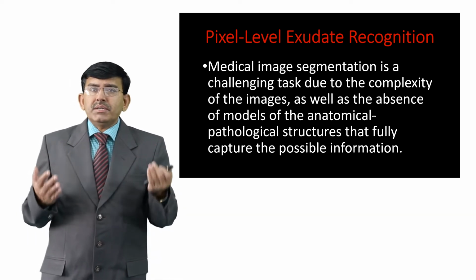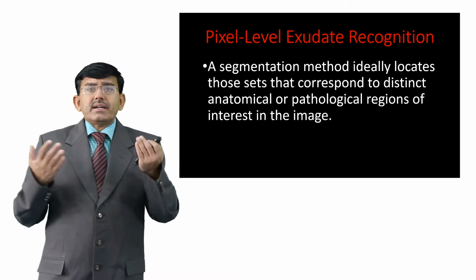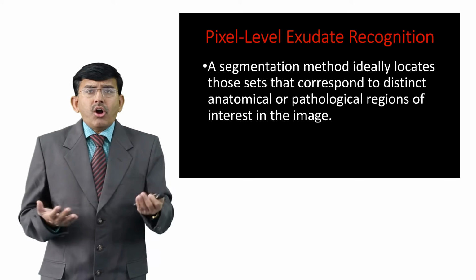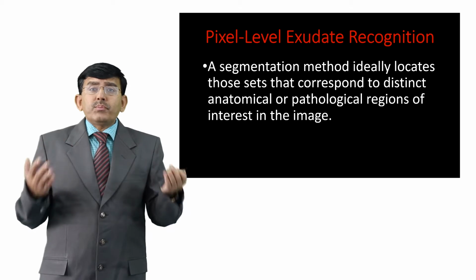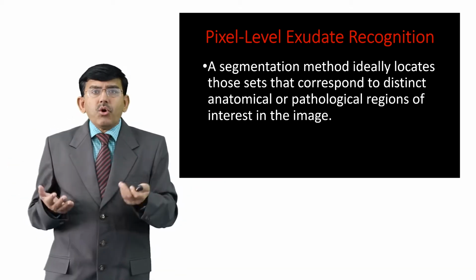A segmentation method ideally locates those sets that correspond to distinct anatomical or pathological regions of the image, which are our target for the process of grouping, clustering as well as classification and so on.